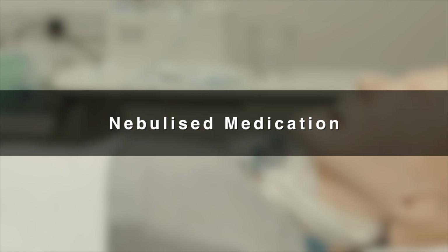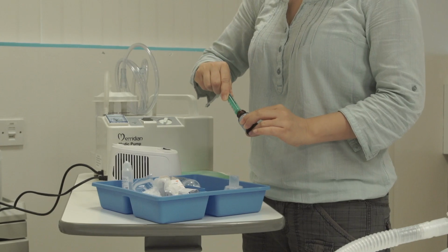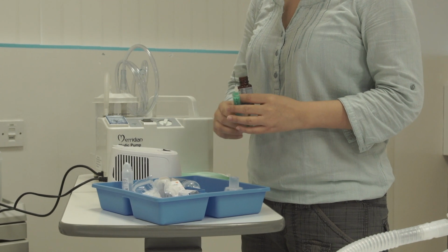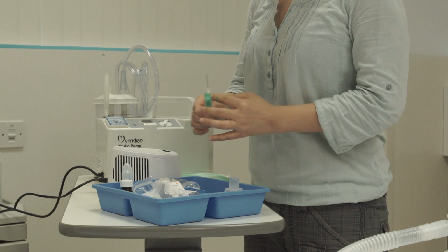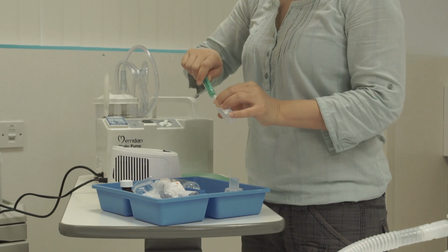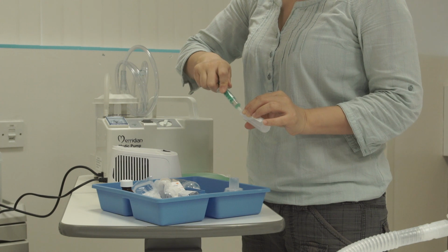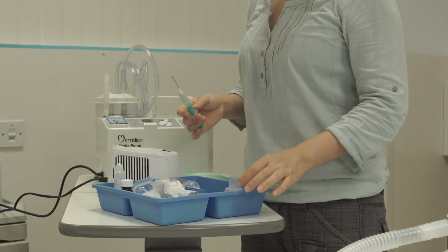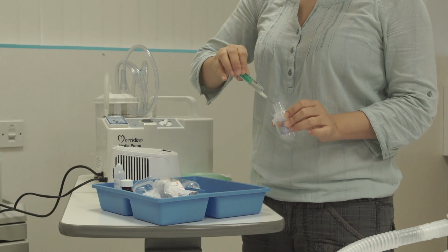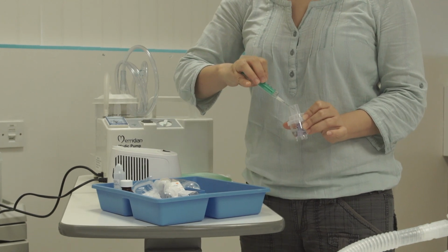Nebulizer is commonly used to administer medication for loosening secretion and opening up of the airway. It can also be used to administer antibiotics. Prepare your medication according to the doctor's prescription. Inject it into the nebulizer chamber.